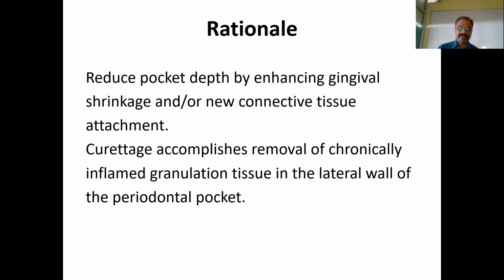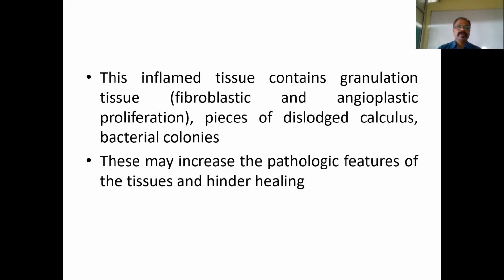So first you're going to do scaling and root planing, and then you intend to use this curettage process to achieve these two objectives. When I say granulation tissue, the inflamed tissue which is present in the soft tissue wall of the periodontal pocket contains a lot of things. Basically it contains fibroblastic and angioblastic proliferation.